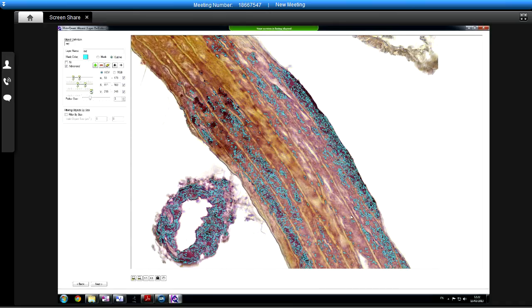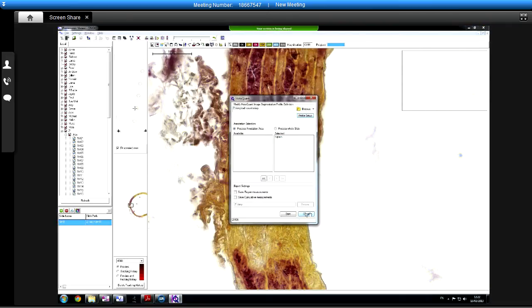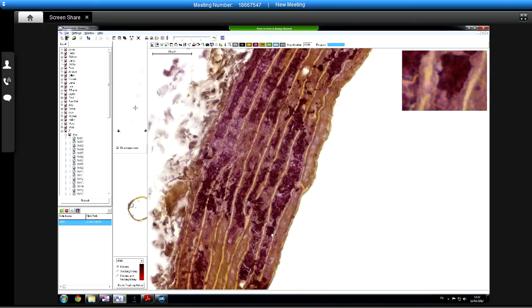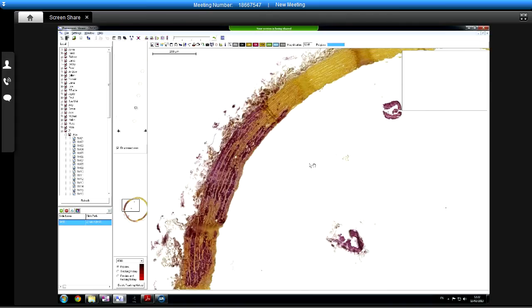Okay, let's pick a different area. On initial inspection, I'd have said this would be the easy one compared to yours, but obviously not. Let's try this area.